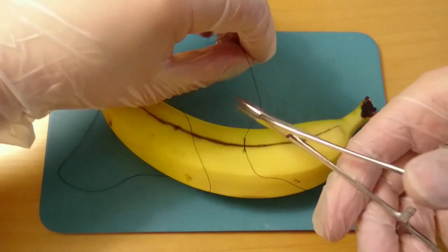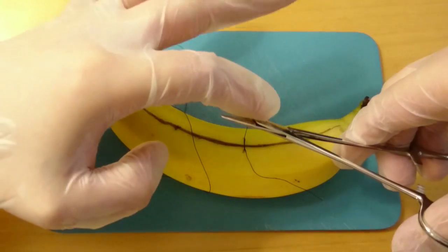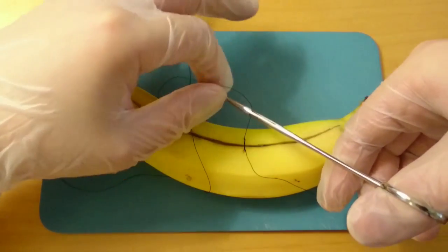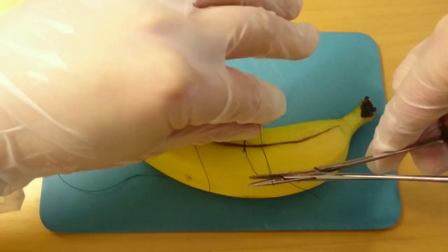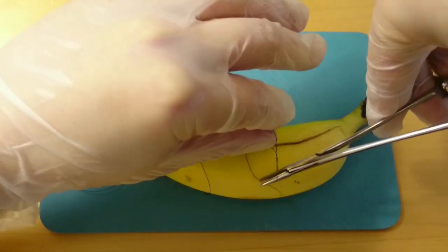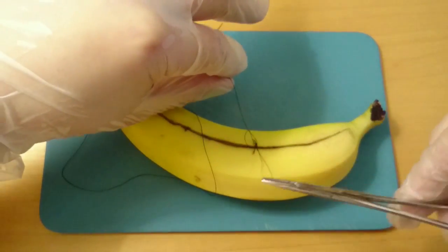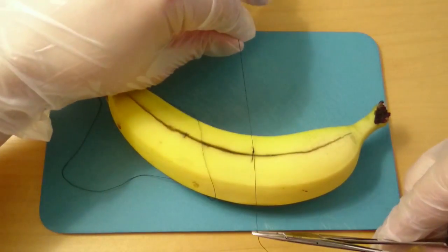Then we do the second, and you start on the backside of the driver, pick up the other one, and pull it through.